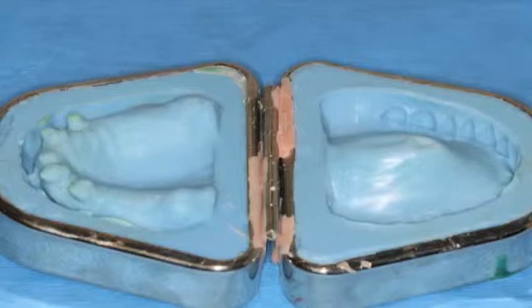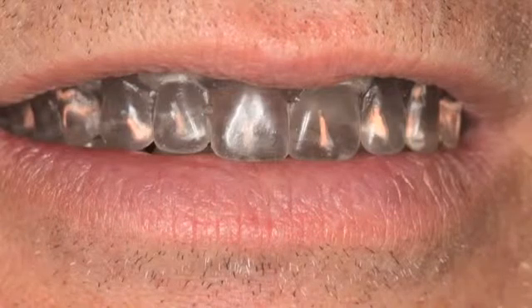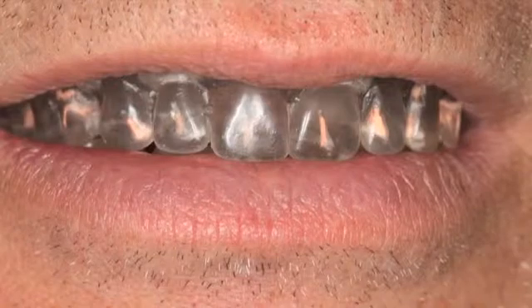Figures 3 and 4 show the patient's properly fitting aesthetic conventional maxillary complete denture, which was duplicated to create a stable radiographic guide. Six to eight radiographic gutta percha markers are positioned in three-dimensional planes. These gutta percha markers are important in determining precise virtual placement of the chosen dental implants using the CT scanning software. We took his existing, properly fitting conventional maxillary denture, duplicated it, and our dental laboratory made a CT guide with 6 to 8 gutta percha markers in three different planes.